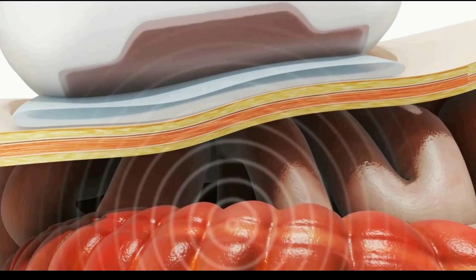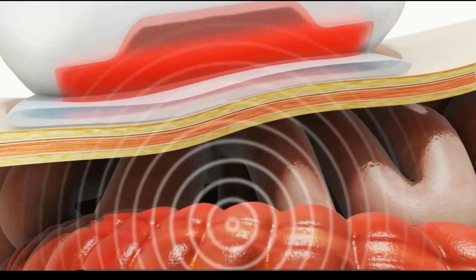But what happens when the molecule relaxes from the excited state back down to the ground state, there's a small amount of heat that's given off because this process is not a perfect process, and a thermoelastic expansion is created around that molecule, and that makes a spherical pressure wave. And we detect that by using an ultrasound transducer. And that's what's depicted here by this cartoon with these spherical waves.